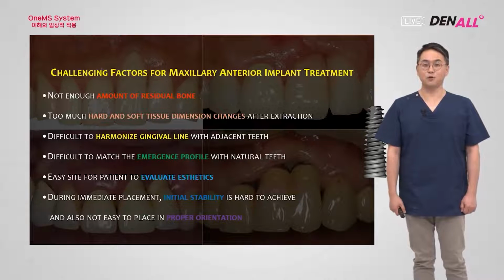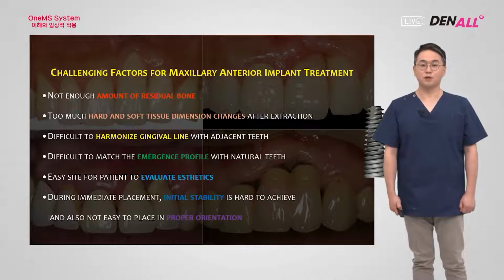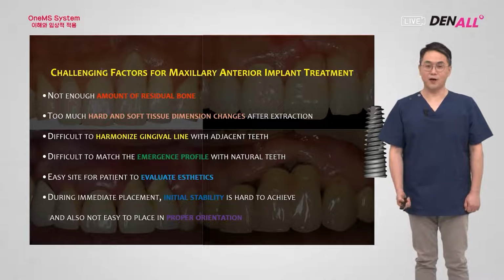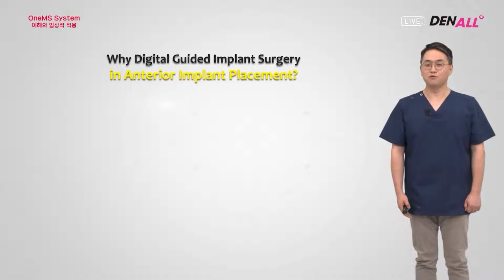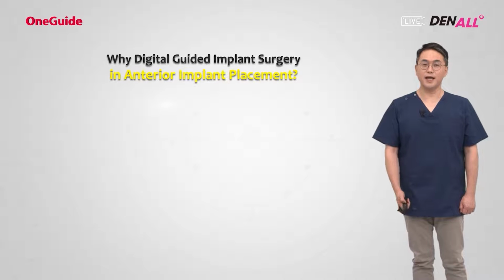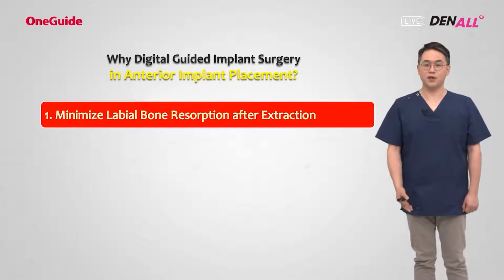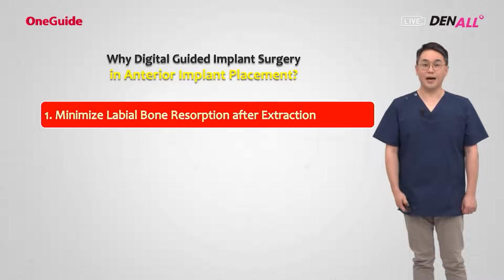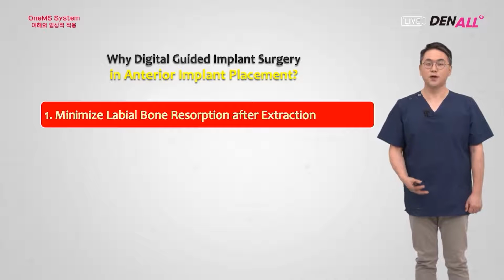And it's an aesthetic area. So if you place the implant wrong compared to a bridge or the conventional method, it can become less aesthetic. You know all this part very well, so I will skip that. Then, why in the anterior part do you need to use a digital guided implant surgery system? There are 3 reasons. First, after extraction, inevitably there is bone resorption, but with this system, such resorption can be minimized. The thin labial bone will be resorbed after extraction, so you have to carefully take the tooth out.